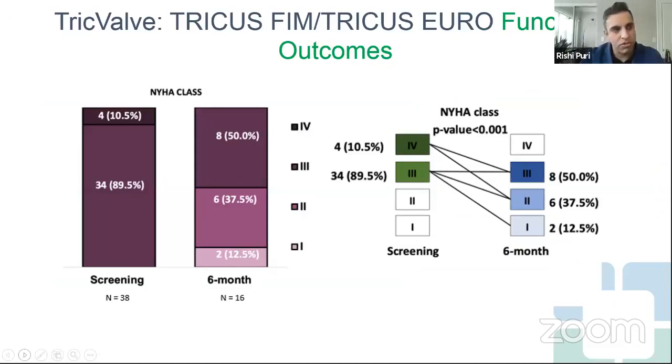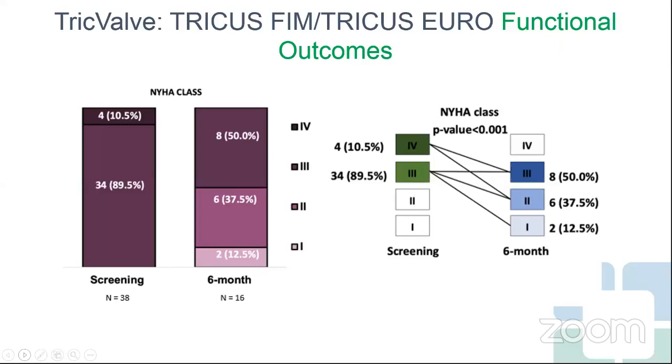In our institution, we have a number of our patients with TAVI who we send home the same day. When you think about how TAVI started and where we are now, we're going to see the same results. We're even sending MitraClips home the same day. This is a venous procedure. I don't see any reason why a TricValve patient couldn't go home the same day once we start to get good at this procedure and do lots of it.